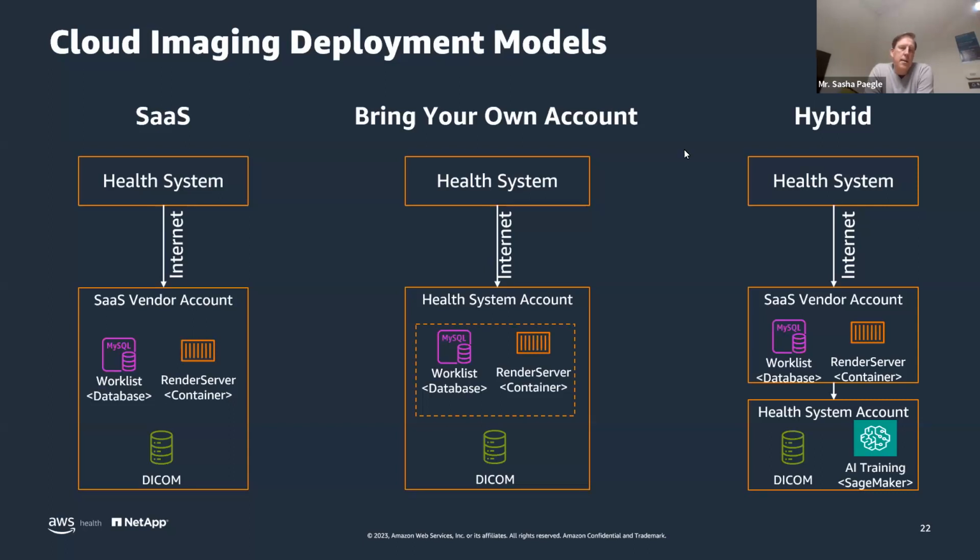And another area to consider and to discuss with your ISV partner is, are there opportunities to host data where you retain control of the data, but you just provide access to it to a particular software as a service? And maybe that may allow you additional flexibility to enable additional applications from different ISV partners. So implementation patterns are something to consider.